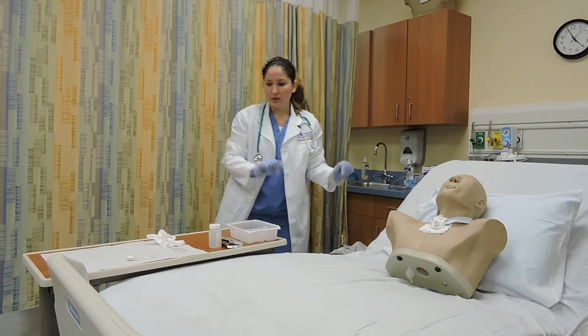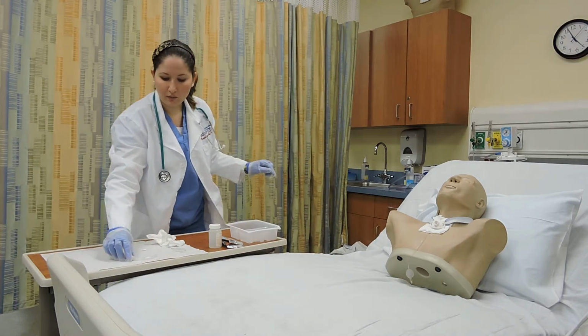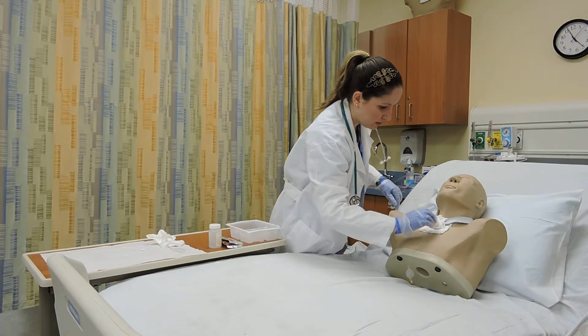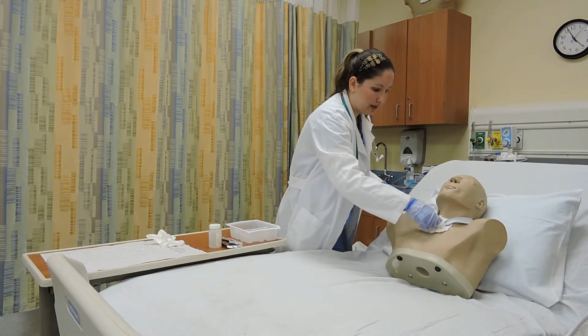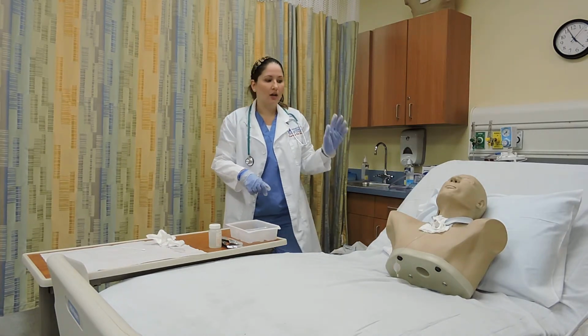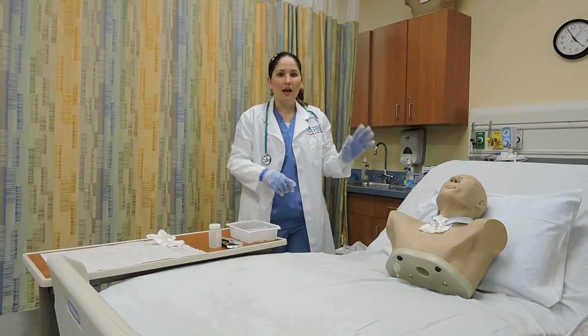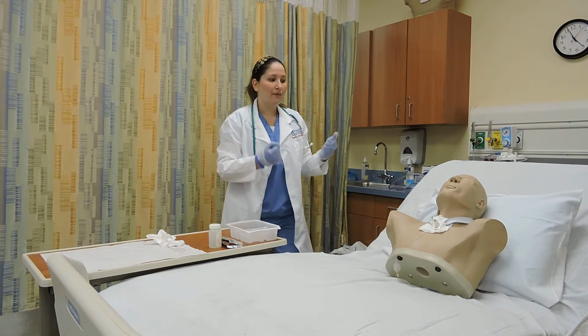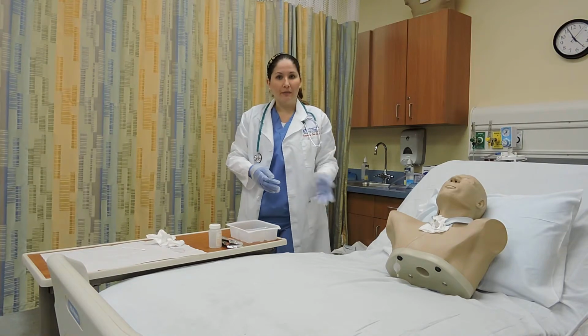Okay, now that the patient is almost ready, we can reinsert the inner cannula and lock it in place. And I'm going to reassess the patient's vital signs, heart rate, respiratory rate, SpO2, breath sounds, and I'm going to make sure that we have airway patency. Before we exit the room, we're going to ensure that the patient is comfortable.